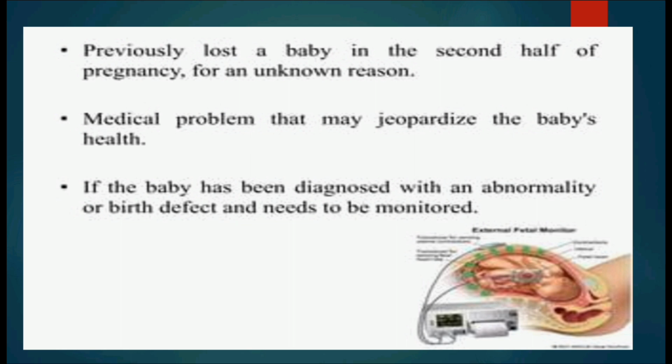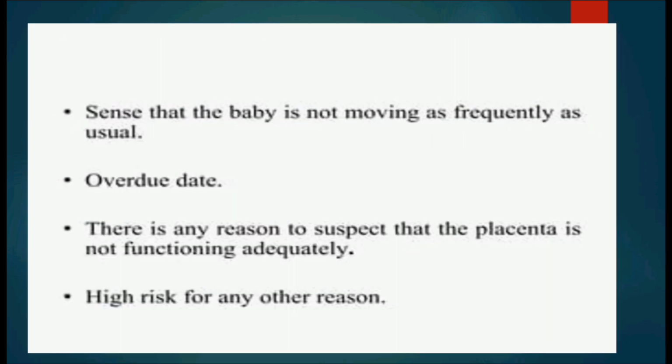Previously lost a baby in the second half of pregnancy without any reason, or a medical problem that may jeopardize the baby's health. If the baby has been diagnosed with an abnormality or birth defect and needs to be monitored during the pregnancy, we do an NST test.